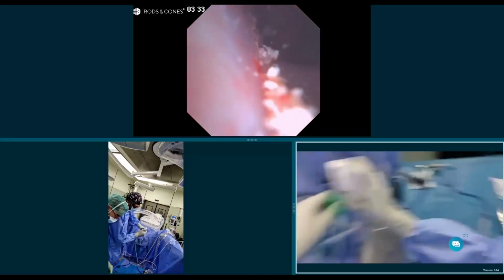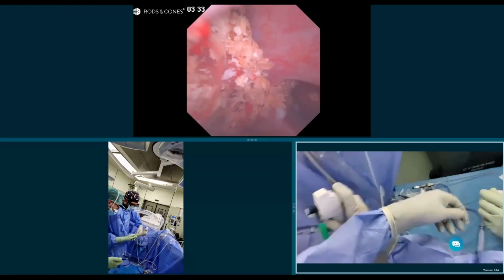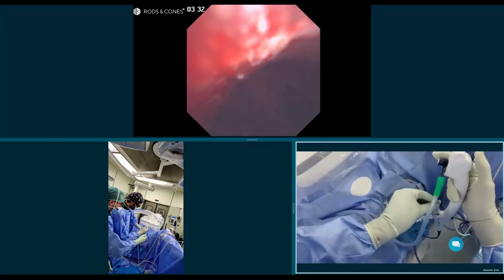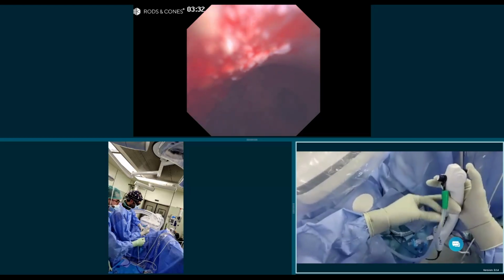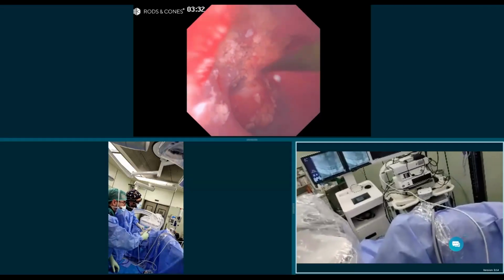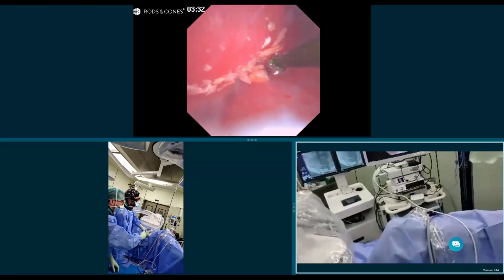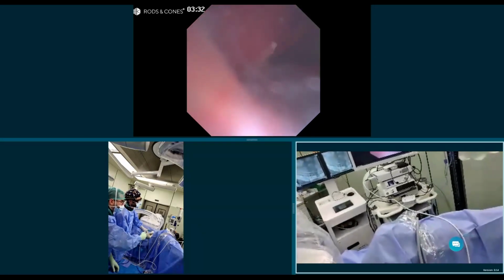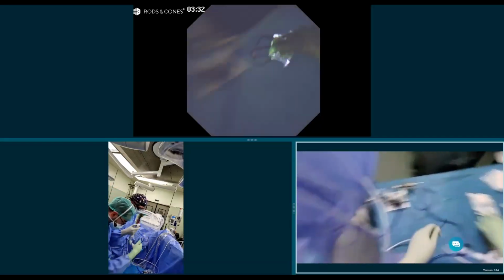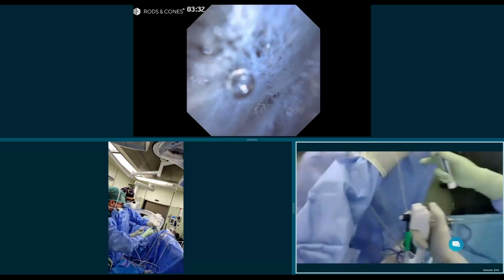Dame una cesta, por favor. I'm going to try to grab one of these small bits for analysis. You need a 1 millimeter stone to have a good analysis, so we always wait till the end to do this. Remember, the working channel is at 3 o'clock. Abre un poco. We have a very small piece. Cierra, cierra, siempre abre un poquito. Cierra. Perfect. Okay, so we remove it quickly. Abre. So with this, we're going to do the analysis. Excellent, we remove it.